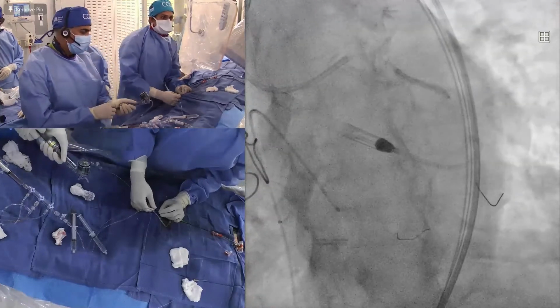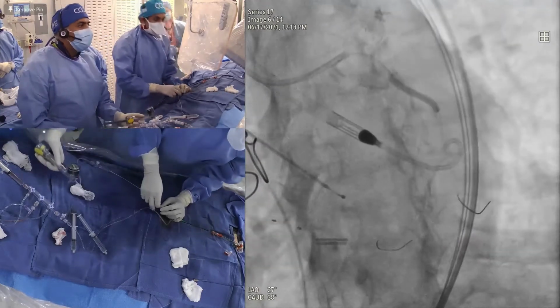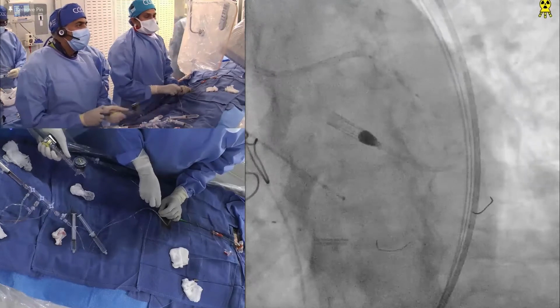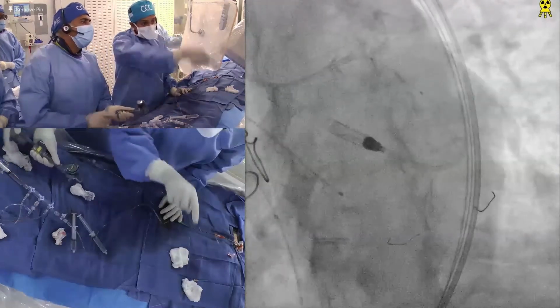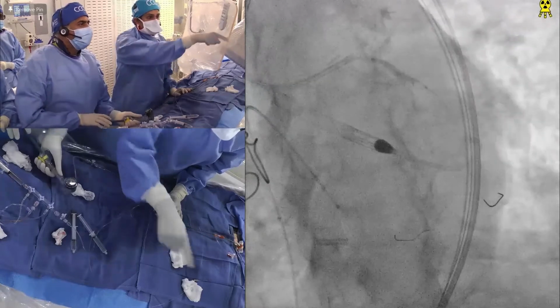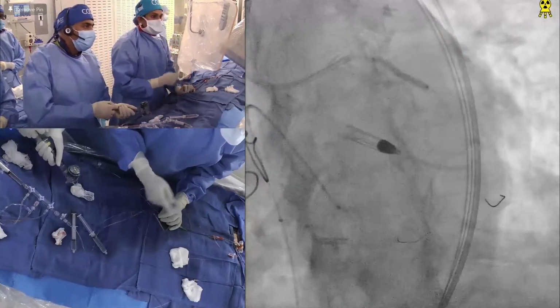We have written very calcific lesion algorithms 3 times already, and now getting some more experience with the shockwave, we are going to put it down what is the best strategy, where the shockwave should be used, and so IVL in combination or alone. And basically, yes, rather than going to the second burr, using a shockwave is absolutely a great choice.